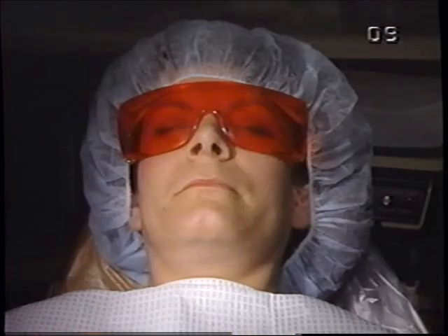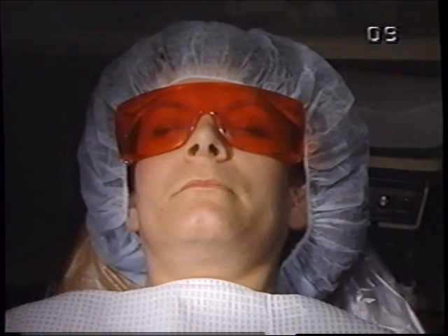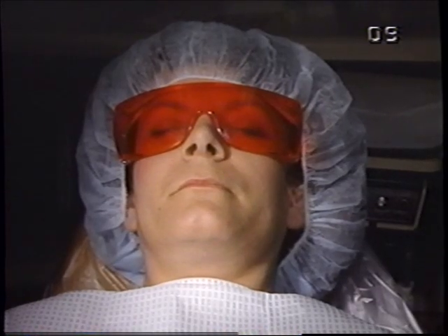Let me show you some instruments that will make it a lot easier to do the types of things that we're demonstrating in this particular tape. First of all, if we want to look at some of these supplies, we have a bouffant cap. Sure, you can use hemostats and towels and wrap them around the patient's head, but we found this to be a very simple and easy and inexpensive way to get the hair out of the field.